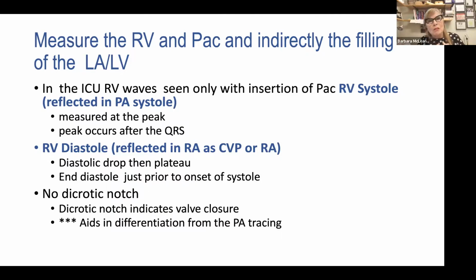That's why we as bedside nurses have to have some expertise. We can guide our physicians in the right way to do it. Tell them when they should be in the right atria. When should they be in the right ventricle? When should they be in the PA? Did they change from a pulsatile pressure to a non-pulsatile pressure? And guide them as to how we're going to use that.